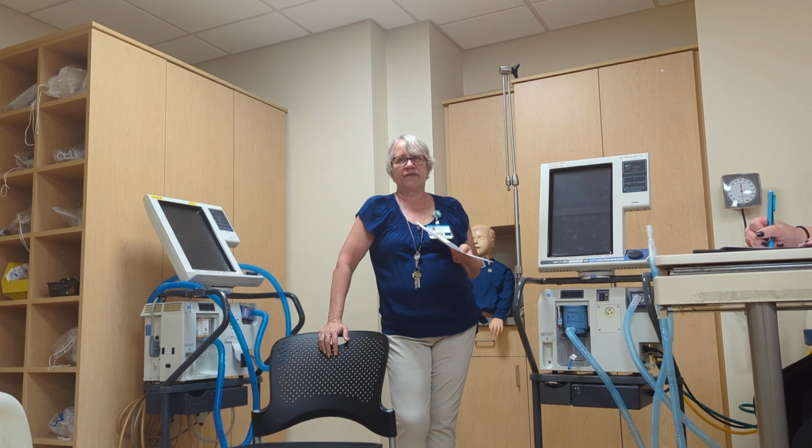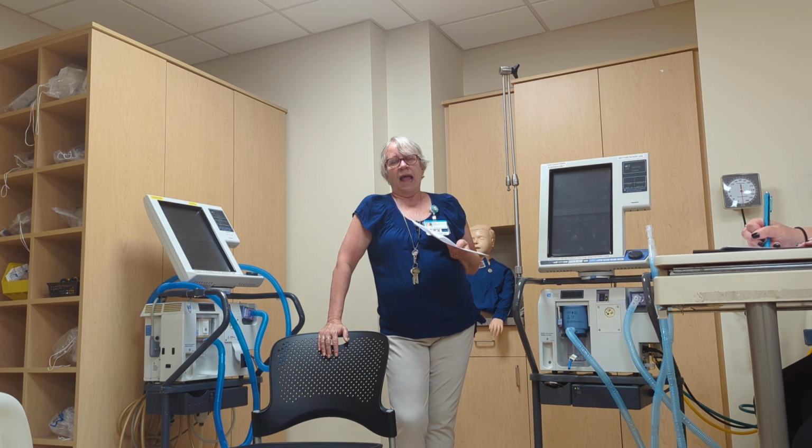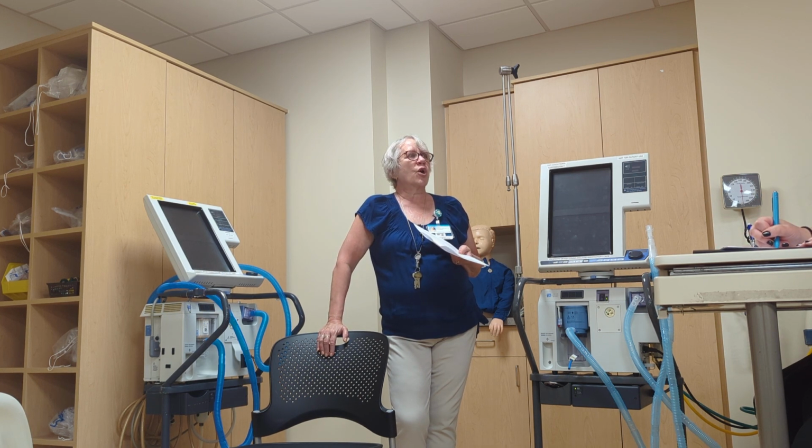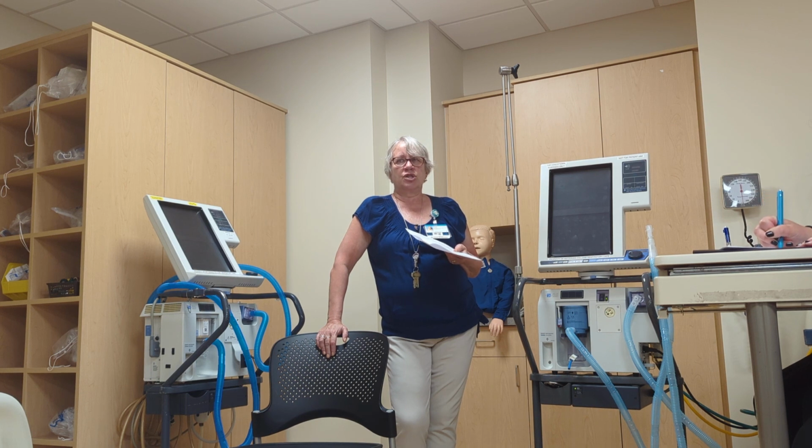The SST is called the short self-test. And that we do to make sure the ventilator is working properly. We will do that, the RTs will do that before you ever put a ventilator on a patient. And you will do it when you do a circuit change, okay?